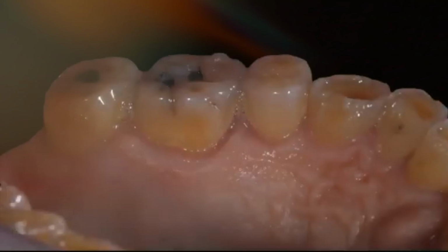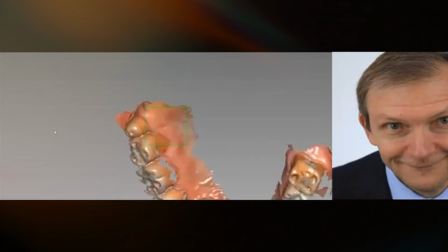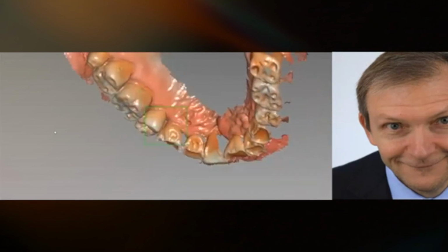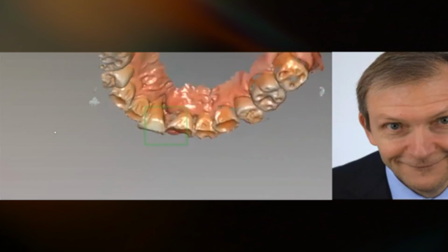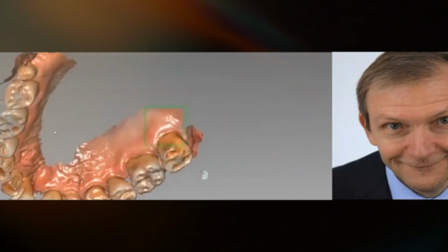Okay, what we did, first of all, we took the first scan, an intraoral scan, in order to do what? To make provisionals with no preparations. There is no preparation, nothing. The teeth as they are, with the erosions.